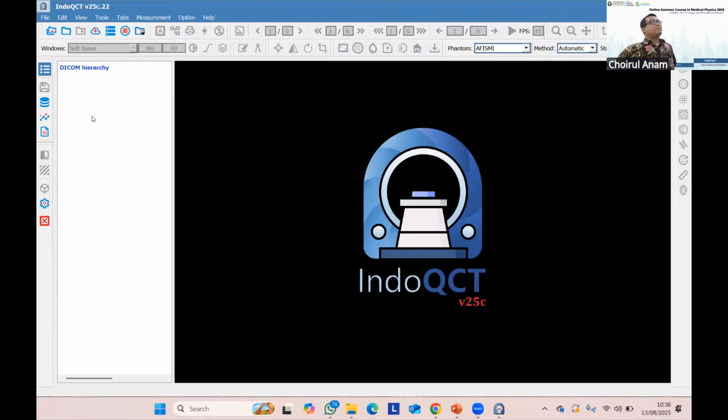Okay, and now we will try this part. If the image is not open, this button is off. And if we open the image, the button will be on.